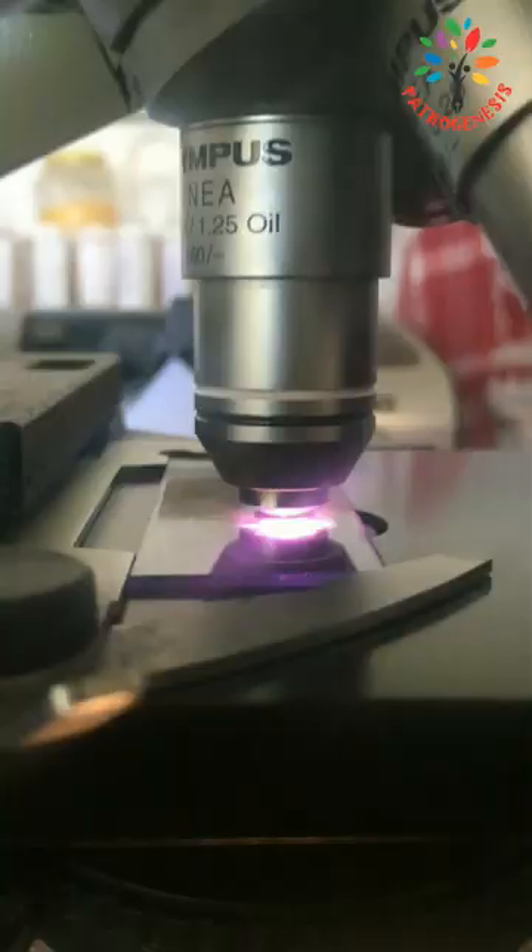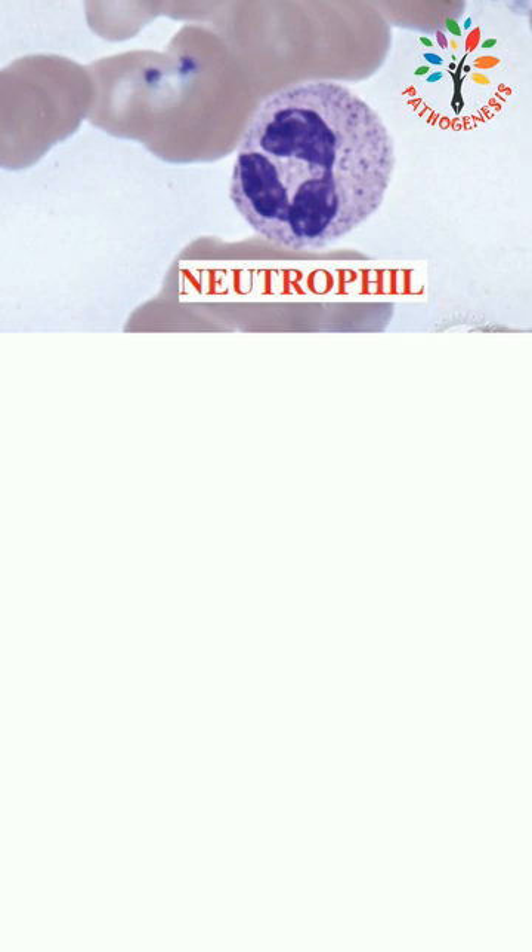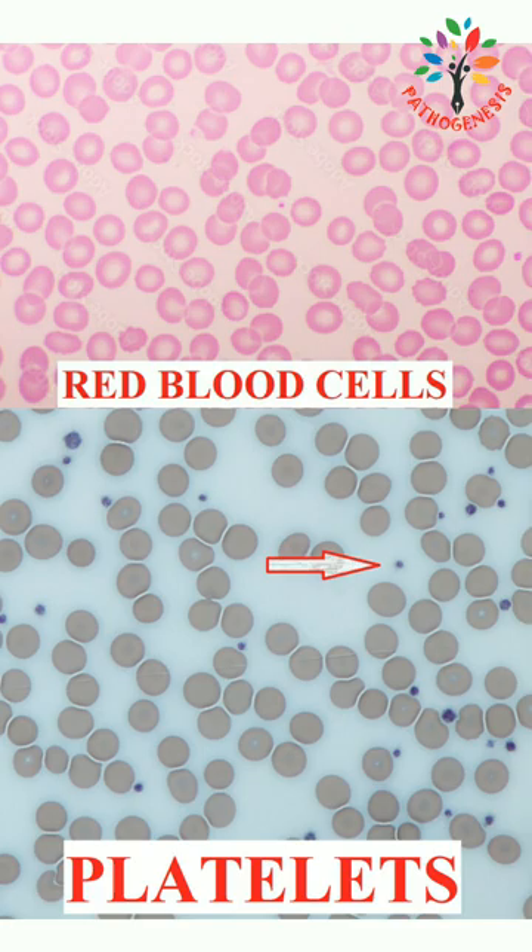You can observe various cells under the oil immersion, such as neutrophils, eosinophils, basophils, lymphocytes, monocytes, red blood cells, and platelets.